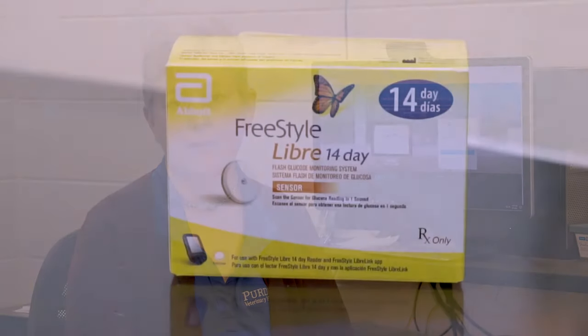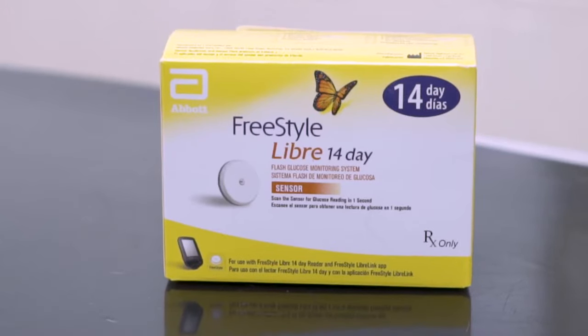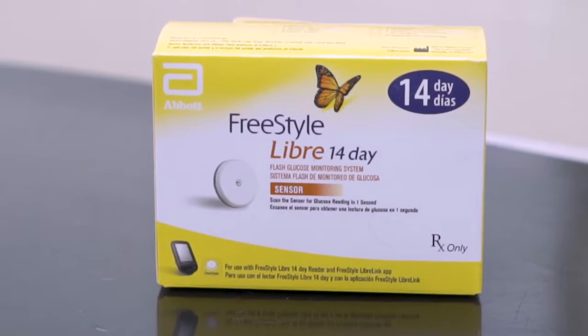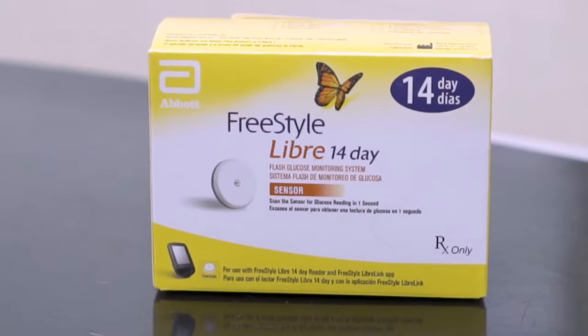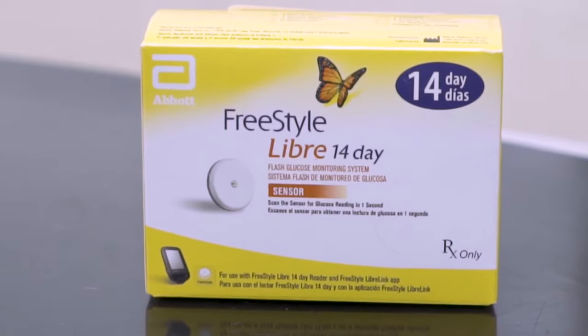Today we're going to demonstrate how to use the Freestyle Libre technology to monitor glycemic control in your diabetic dogs and cats. The Freestyle glucose monitoring system made by Abbott Laboratories measures interstitial glucose every minute for up to 14 days. It is an invaluable tool for monitoring glycemic control in dogs and cats.